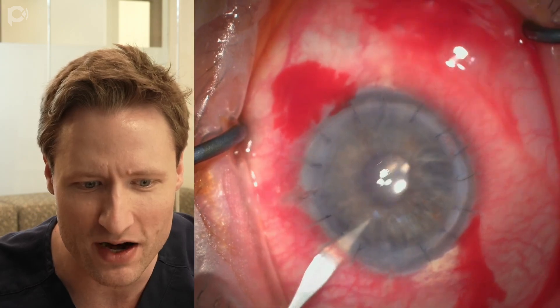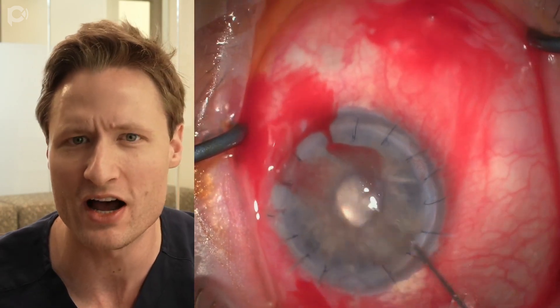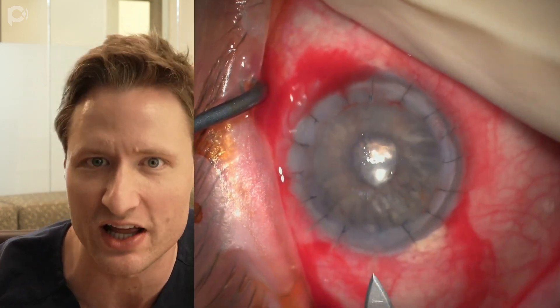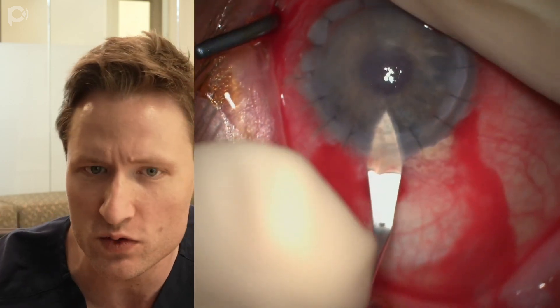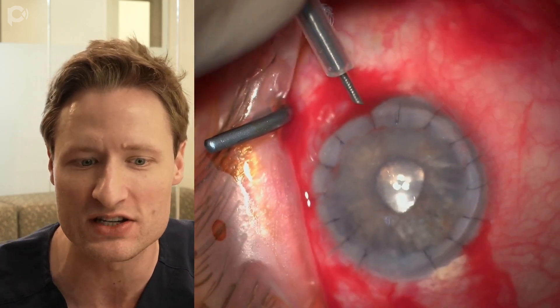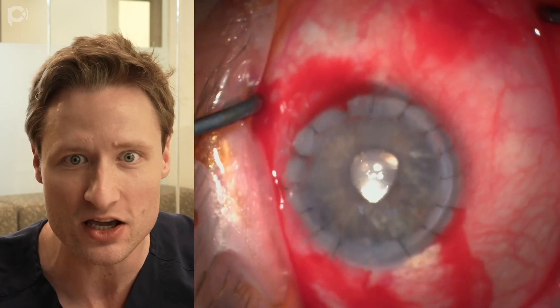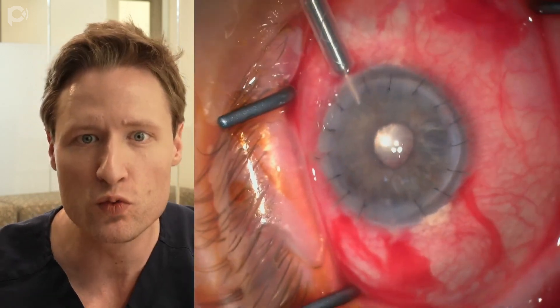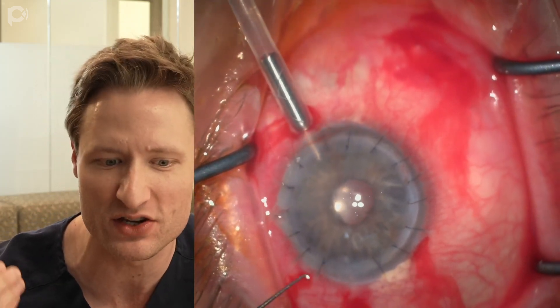The first thing you'll notice is we're making paracenteses, and they're made not at the corneal limbus but rather a half a millimeter or even a millimeter posterior to the limbus in the sclera. The reason I'm making those incisions and the main wound in the sclera rather than in the cornea is because in eyes that have previously had a PK, corneal incisions tend to leak when made in the thinned recipient periphery. Your wounds are more likely to be watertight and airtight if you make them in the sclera.